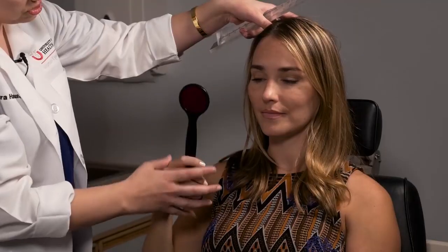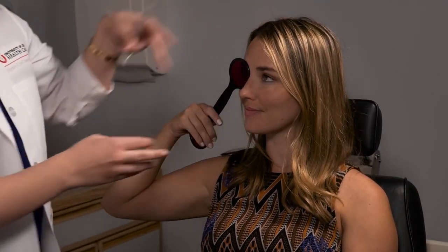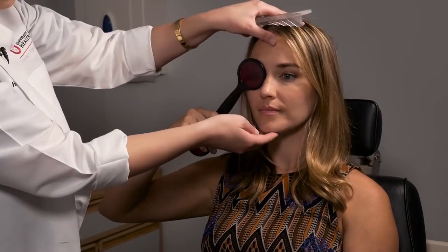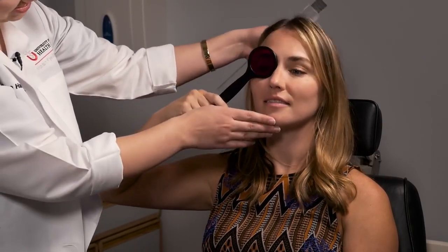So now we're going to turn your head. Good, so this is measuring her in left gaze, so go ahead and look back at the light. Is the light above or below the red line? It's right on it. Right on it, so perfectly aligned there. And how about there, in right gaze? Right on it. Very good, you can also do it in down gaze. Exactly on it. And up gaze. Right on it.